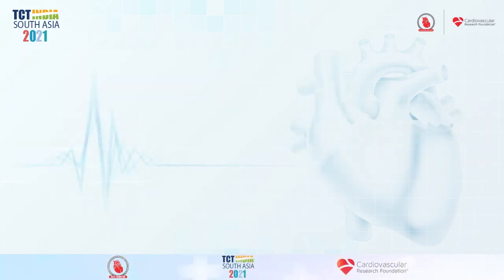Thank you, Selvamani, for showing us the importance of OCT in ISR, and also the importance of OCT in detecting the thrombus and the malpositions and other defects of stents.